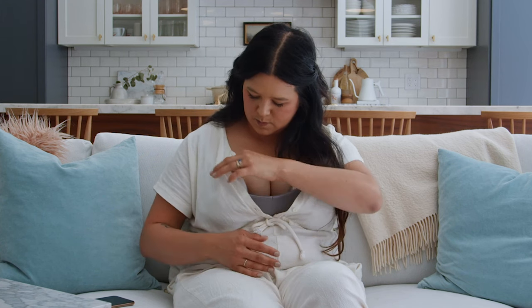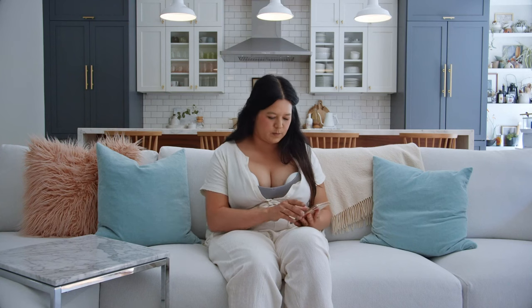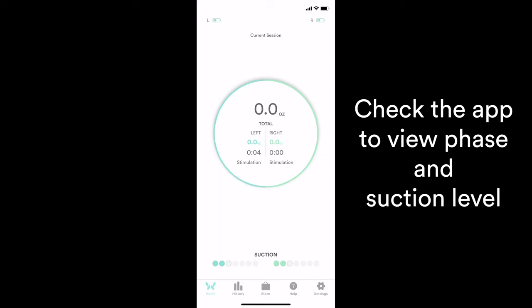If you've chosen the lowest level, the suction won't increase. A great thing to do while in stimulation is to check the app to see if your milk volume is increasing.